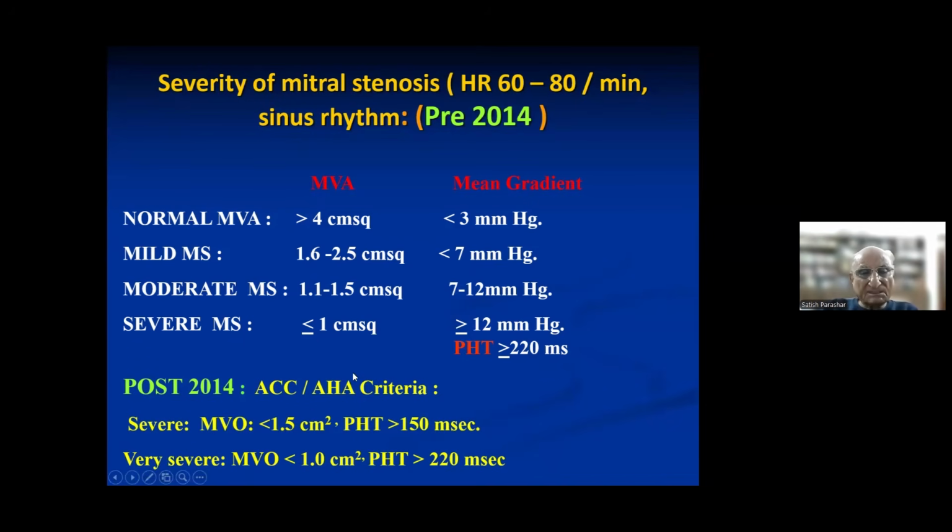But if you can't get it, then you have to give just an idea. Because as you know, even if they are not included, as the severity increases, the pressure and the volume, this mean gradient will increase. Suppose there is a door through which you are pushing two persons at a time, they can easily pass. But if the door is closed, you'll require more pressure to push the two out of the door. So that is the same thing.